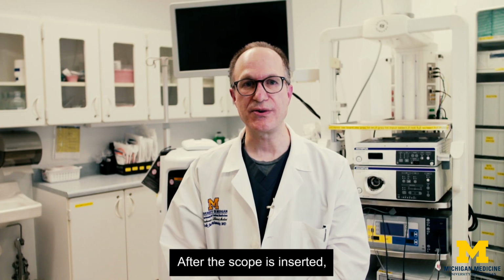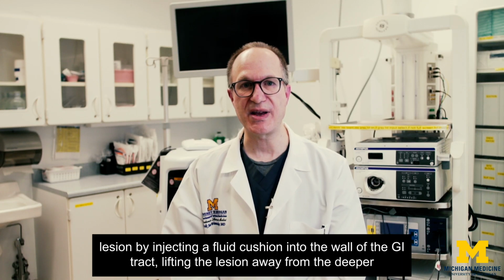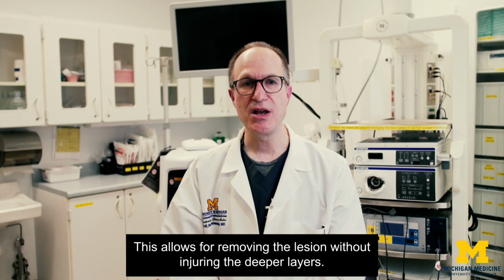After the scope is inserted, the endoscopic mucosal resection can be done. The gastroenterologist removes the concerning lesion by injecting a fluid cushion into the wall of the GI tract, lifting the lesion away from the deeper layers of the lining of the GI tract. This allows for removing the lesion without injuring the deeper layers.